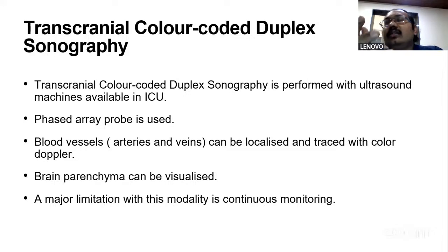But the one disadvantage is that there is no continuous monitoring available with this. In traditional TCD, we have a headset, so we can use it for continuous neuro monitoring. Whereas for this machine, such a technology doesn't exist.